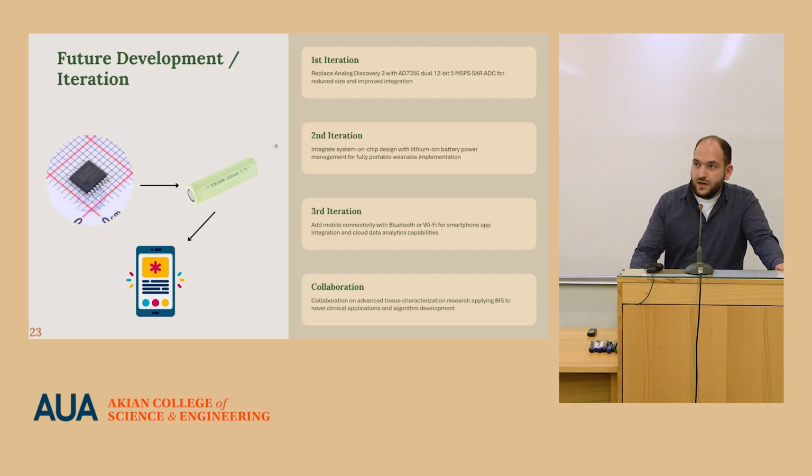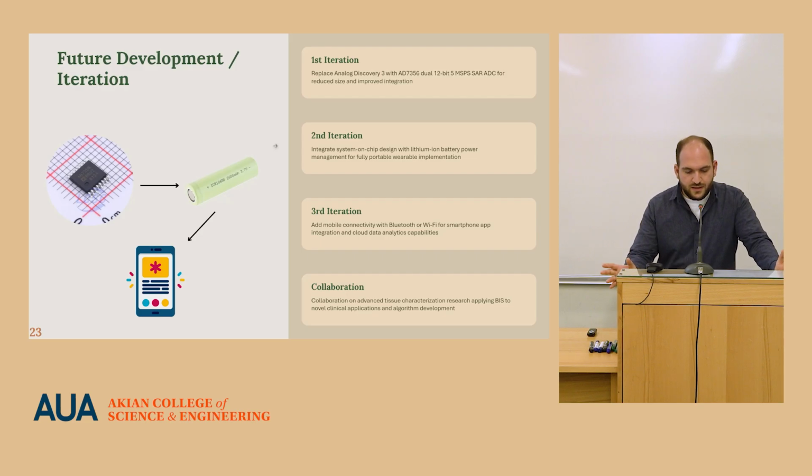In addition, during the poster presentation, some people from Orbally approached us and made an offer for collaboration. They made a high voltage device to inject the cell membranes. Their device does not have the capability to measure impedance, and our device does. So they plan to collaborate and integrate our device into their systems.